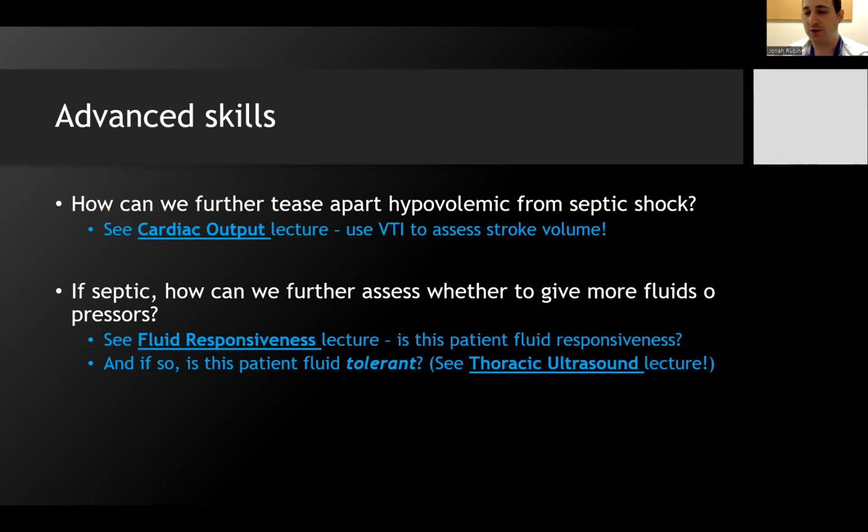But if you can use your echo to both guide your ultrasound probe to guide whether this patient is fluid responsive, is fluid tolerant, needs fluids at all, that's a lot of power that you can get very quickly with a couple of minutes with an echo probe at the bedside.